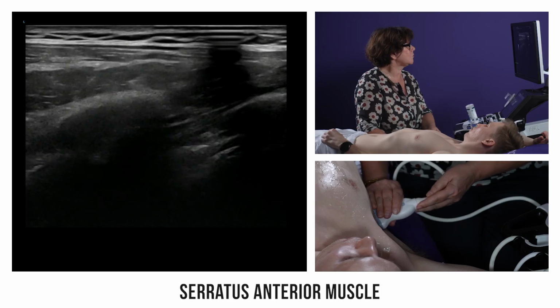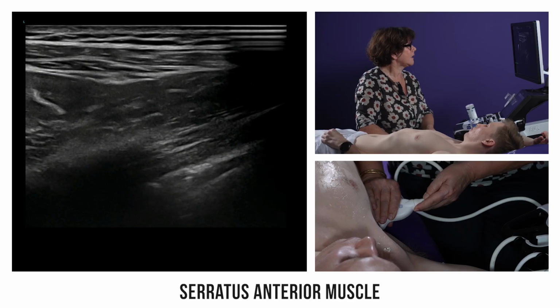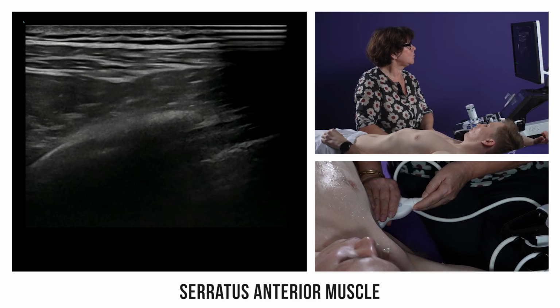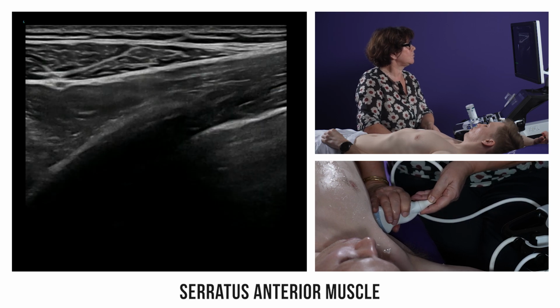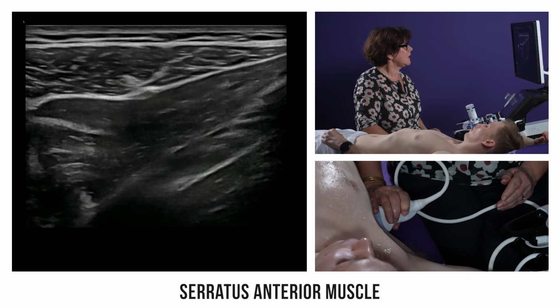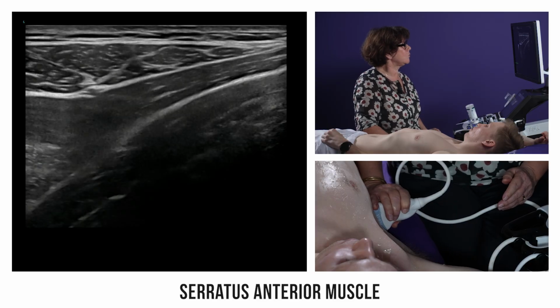Rotating the probe 90 degrees reveals again the long thoracic nerve running over the serratus. Superficial to this serratus anterior, we find the latissimus dorsi, which Marie will discuss shortly.